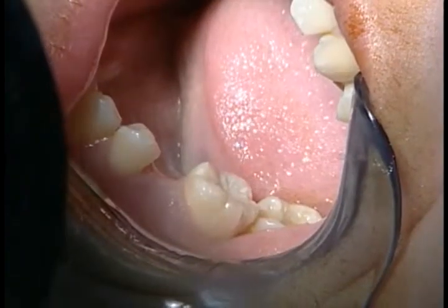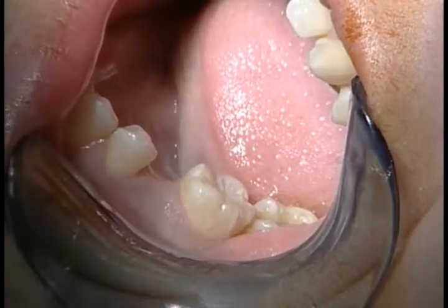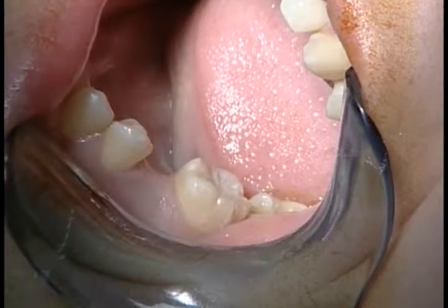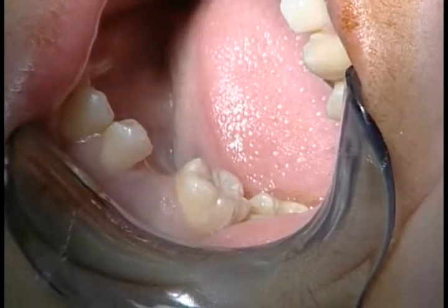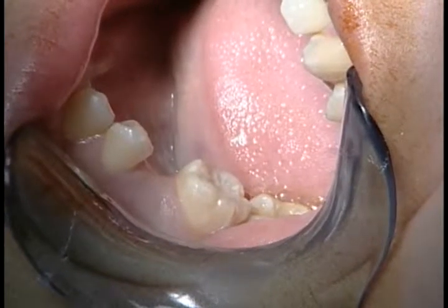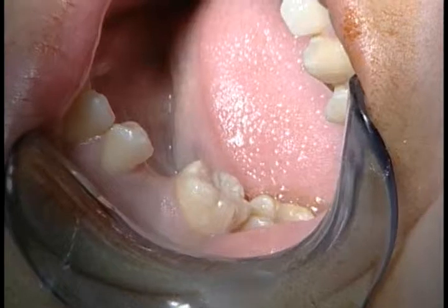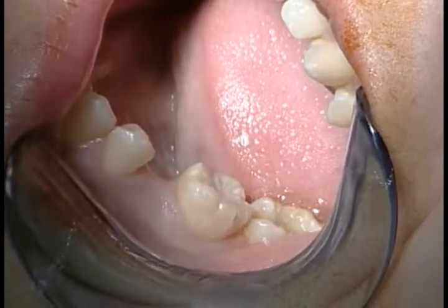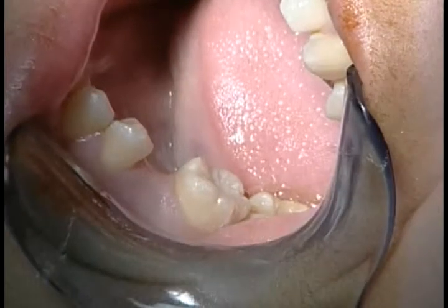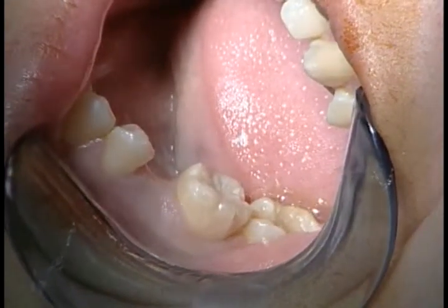As we look at this case from a clinical aspect, we see that the distance between the coronal aspects of the adjacent teeth is ideal for the anticipated crown. Obviously, with the adjacent teeth without restoration, an implant is the treatment of choice. The soft tissue health is ideal. Surgery should not be performed until the overall periodontal health of the patient has been verified. And if the patient is in need of periodontal treatment, that phase of the treatment should be completed prior to the appointment to place the implant.